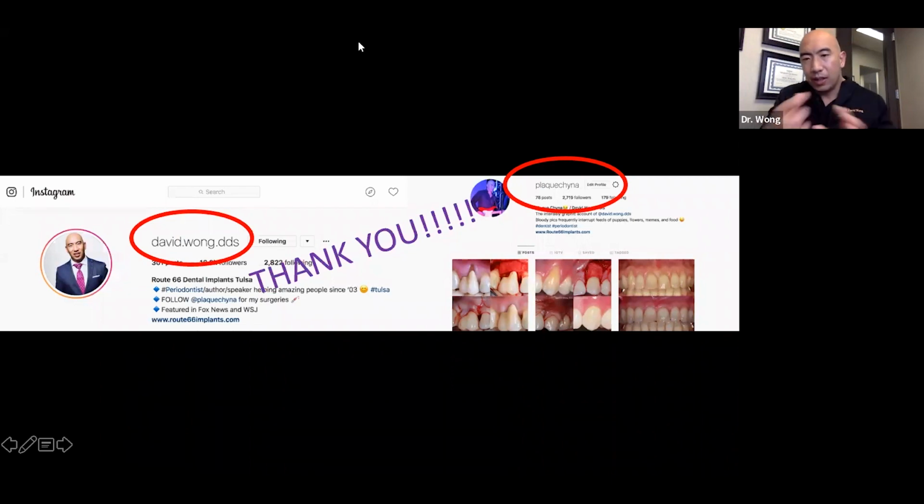So you don't have to do anything. It'll just fold over. And because it's Memlock, once it gets wet and hydrated, it should normally stay down. And if that doesn't work, your figure 8 suture over the top will cinch it down. So I hope that answers that question.